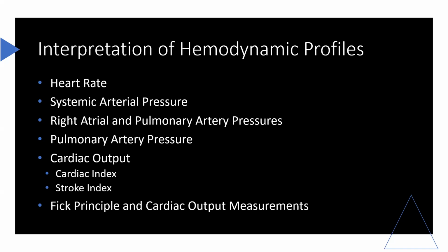With positive pressure breathing, the curve rises as intrapleural pressures become positive and falls during the expiratory phase. The intrapleural pressure is the same for spontaneous or negative pressure and positive pressure breathing at the end of expiration, as long as PEEP is not used. For this reason, PA pressure by convention is measured at end expiration.